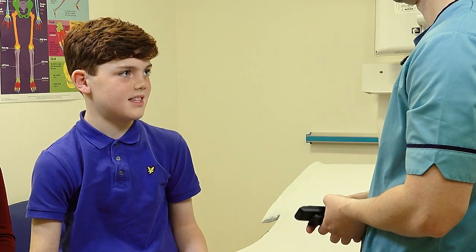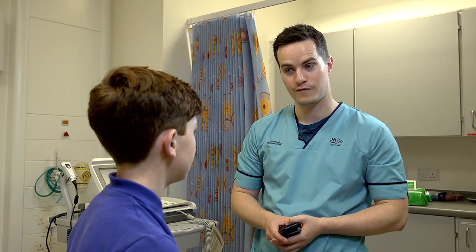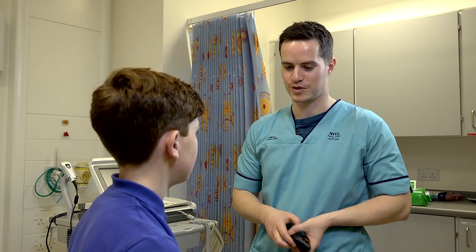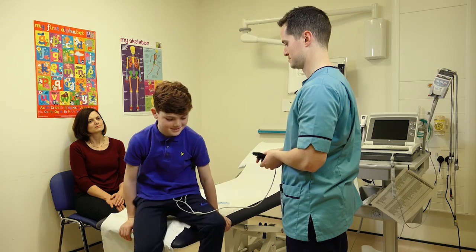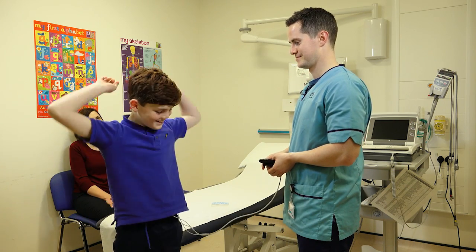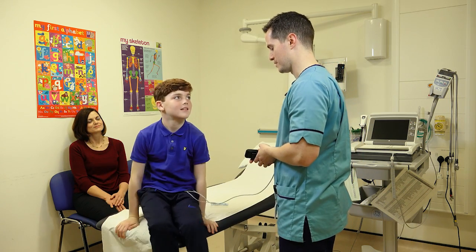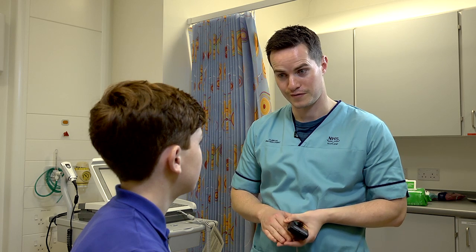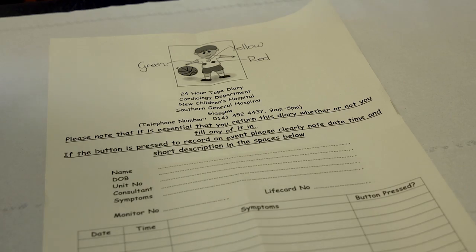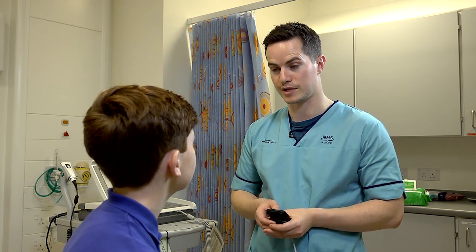Will any of these stickers fall off when I'm doing sports? The stickers shouldn't fall off, no. But what we'll get you to do is wave your arms about like this, just to make sure none of them fall off — do you want to try that now? Are they still on? Good. If any of them do fall off, there's a diagram at the top of the diary. The wires are colour coded and they can just be stuck back on with some of the spare electrodes we'll give you.